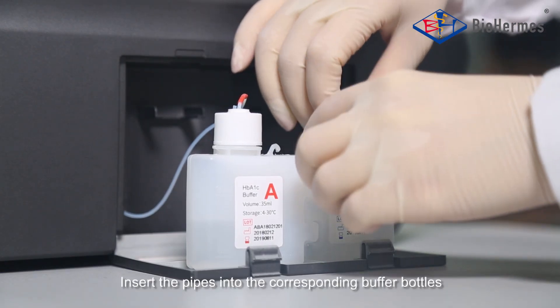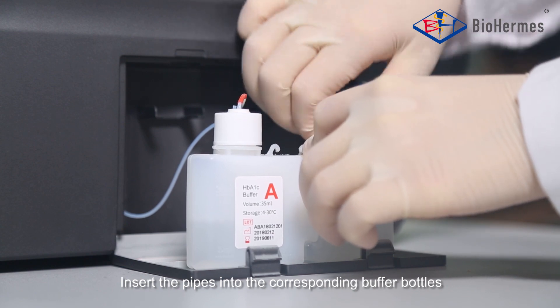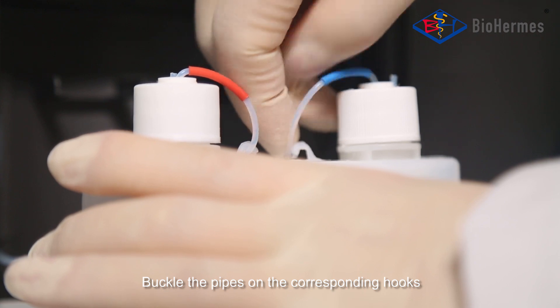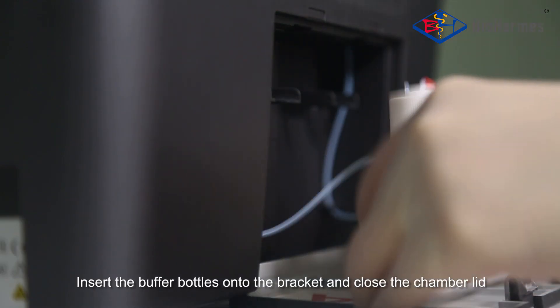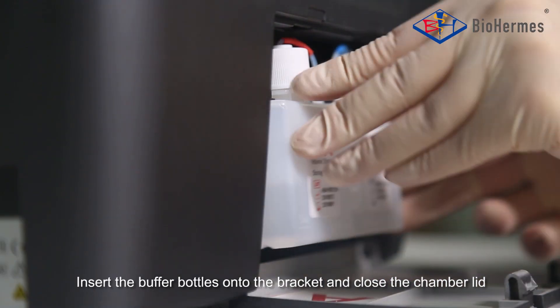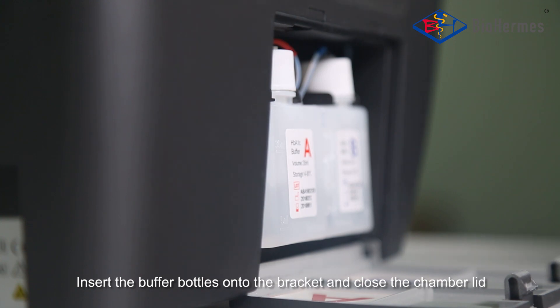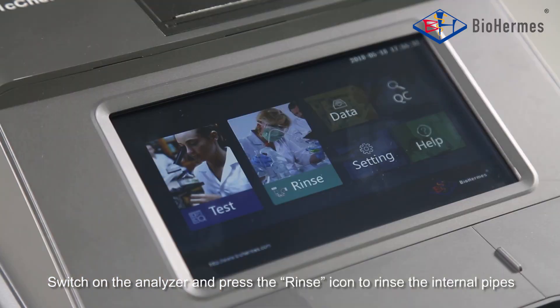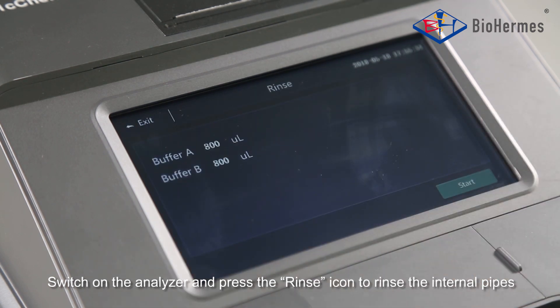Buffer Bottle Installation: Insert the pipes into the corresponding buffer bottles. Buckle the pipes on the corresponding hooks. Insert the buffer bottles onto the bracket and close the chamber lid. Switch on the analyzer.